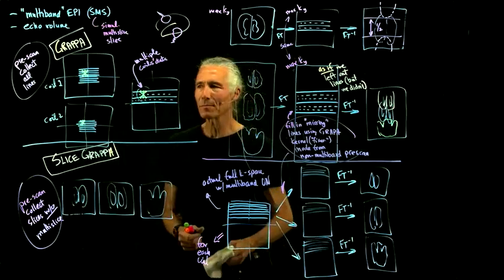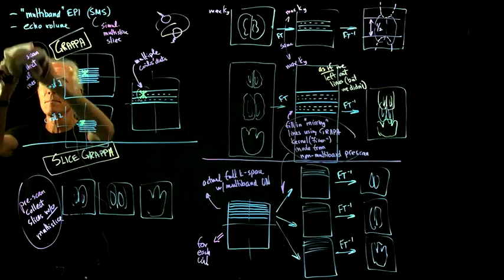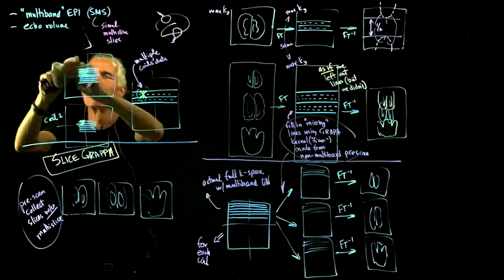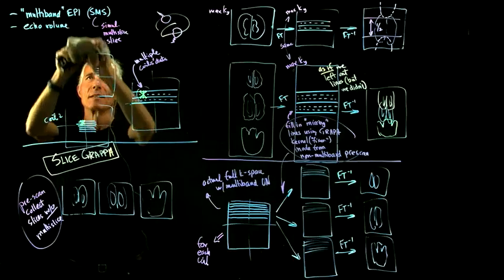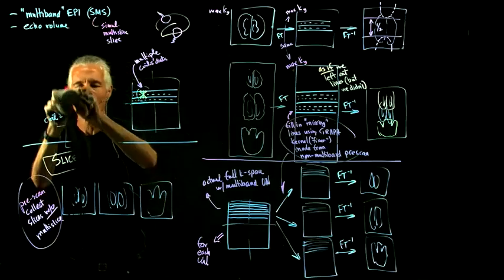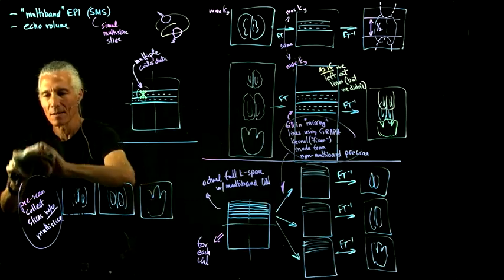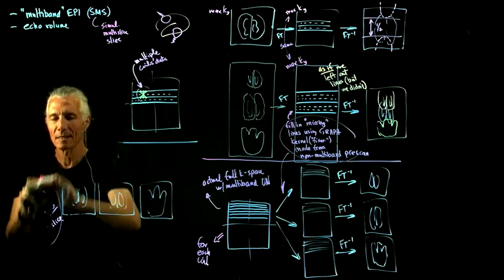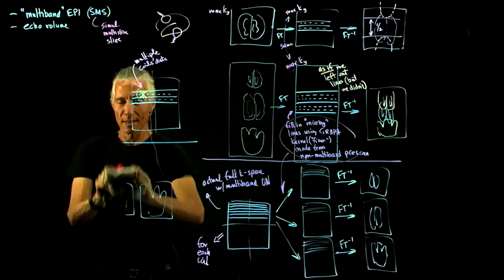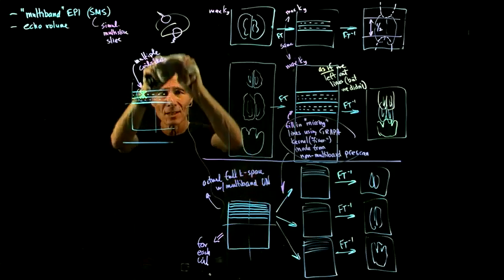And so one of the problems with these kinds of methods, same with GRAPPA, is if you move during the very start of the scan, it could potentially screw up the whole rest of the scan. And this is particularly important in a functional scan, because typically what happens when you're doing this pre-scan is the task hasn't started yet, because you've got to do that 20, 30 seconds of data collection before the scan actually starts.